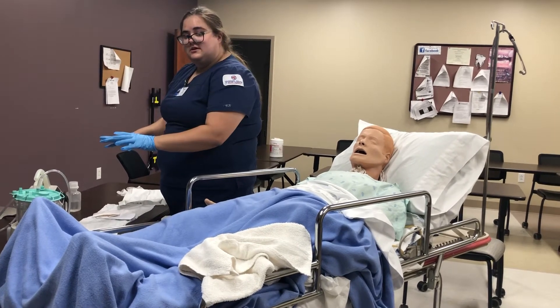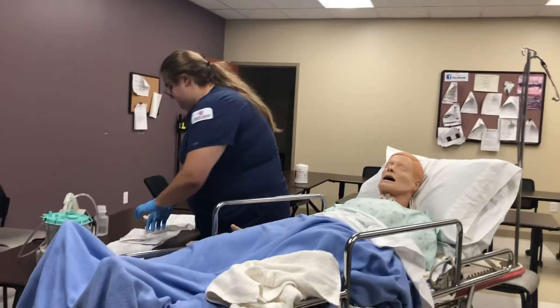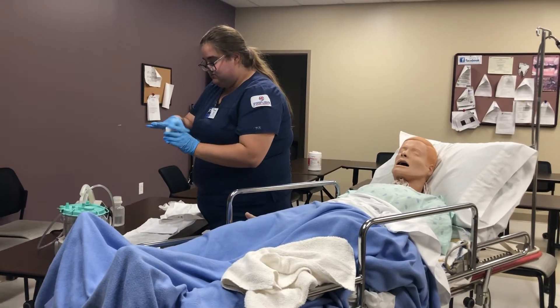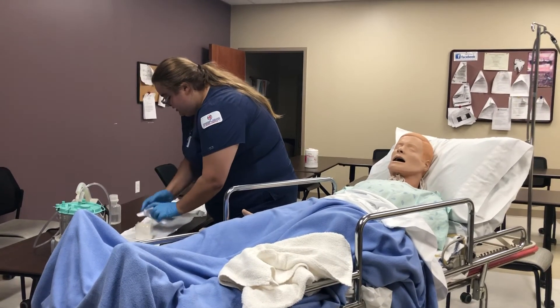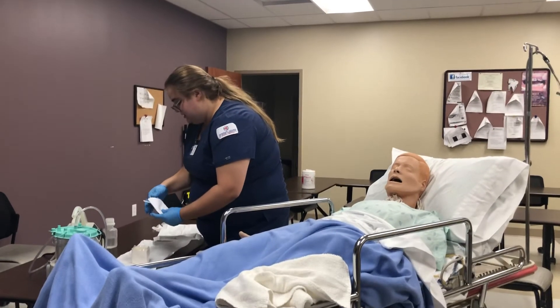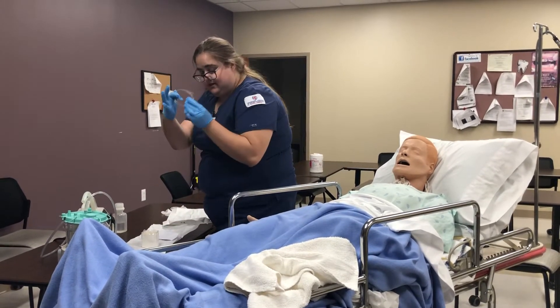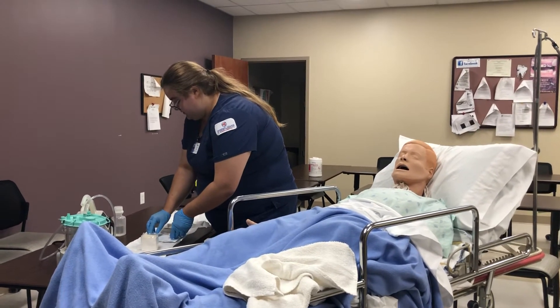I will get my supplies prepped and ready. You open the little box for your normal saline, and I'm going to pull out my suction catheter to be prepared when I'm ready to use it.